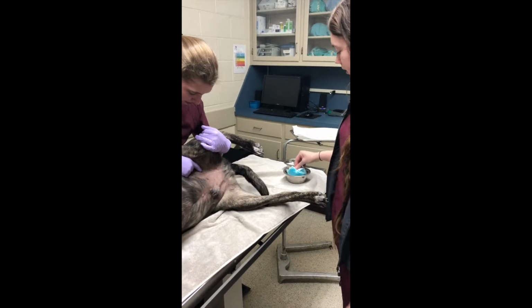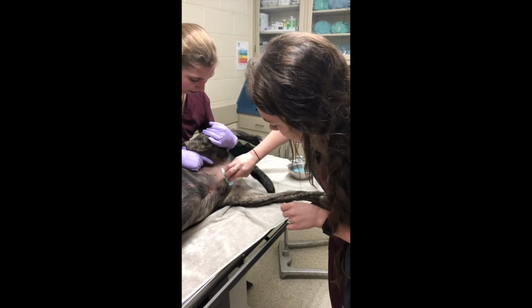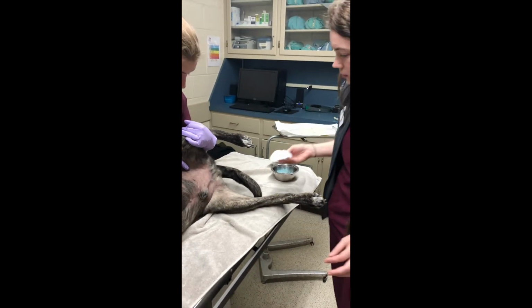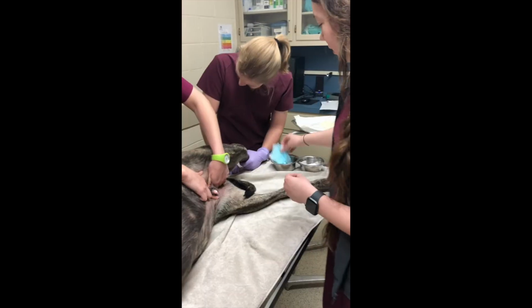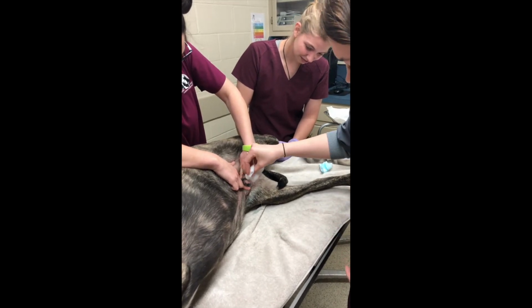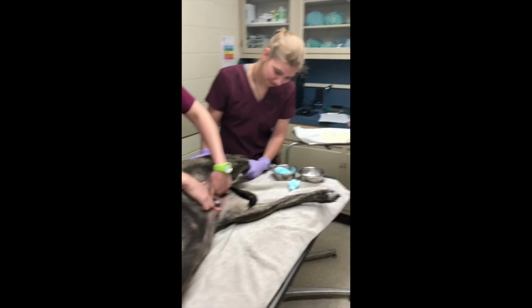Okay, we're going to start with cleaning the outside of the prepuce with Chlorhex. And then I'm going to just rinse it off with water. Okay, I'm now going to rinse it with this Chlorhex scrub solution and water. And then I'm going to put on my sterile gloves.